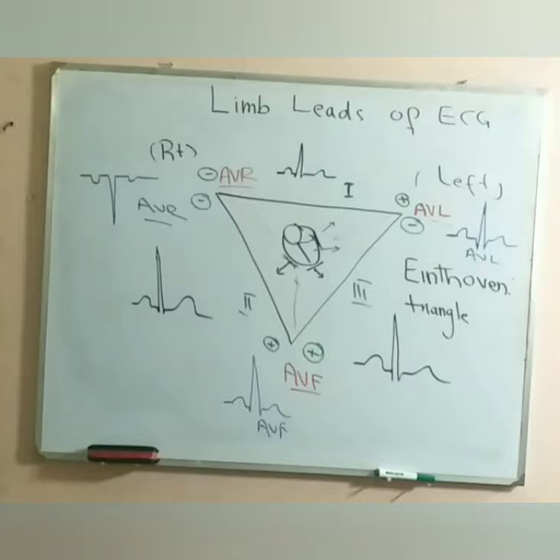But when we look at the augmented voltage leads, AVR, augmented voltage right, AVL, augmented voltage left, AVF, augmented voltage foot. So these were devised later on. These are the smart machines. Now they have devised the way to gather information and generate these augmented voltages.